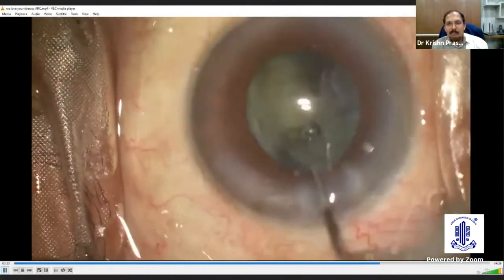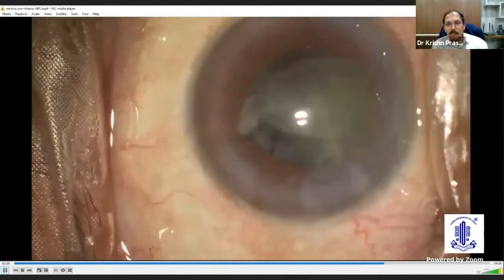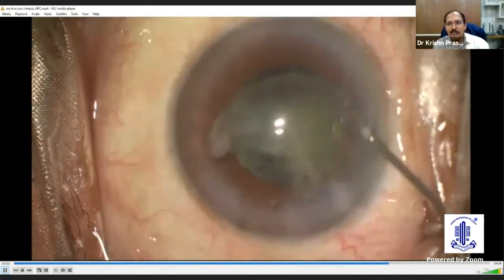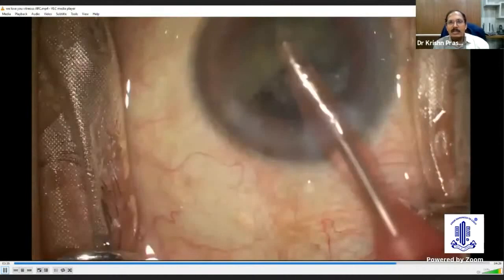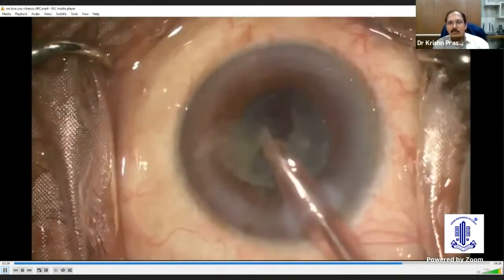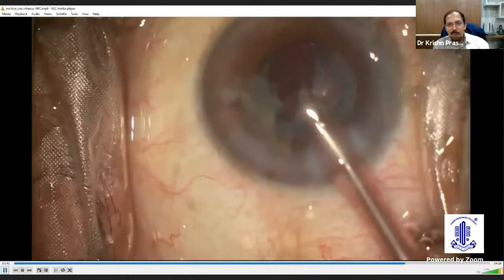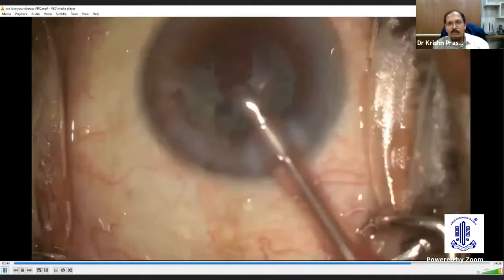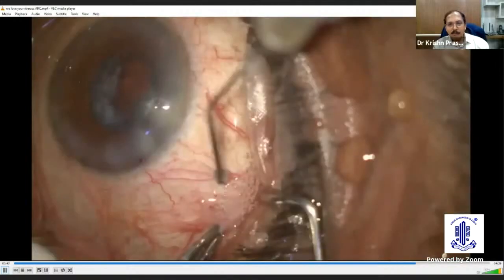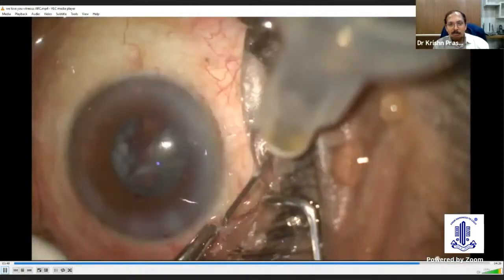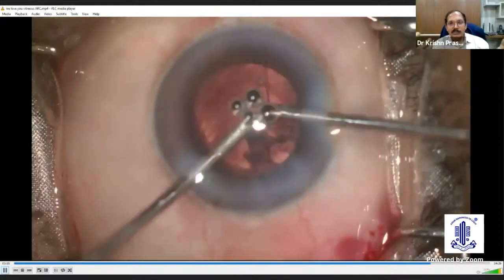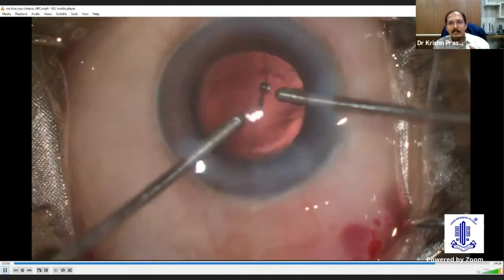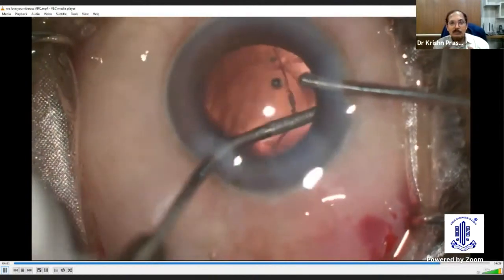Without that scaffold, a lot of nuclear material has gone down into the posterior segment. He tries to salvage the situation by removing as much as possible from the anterior chamber. He tries to make way, aspirating as much as possible. Eventually the posterior segment team takes over. The nucleus is gone, he removes remaining parts. There is a large posterior capsule rent and vitreous is presenting. Pieces that were dropped inside are noted.